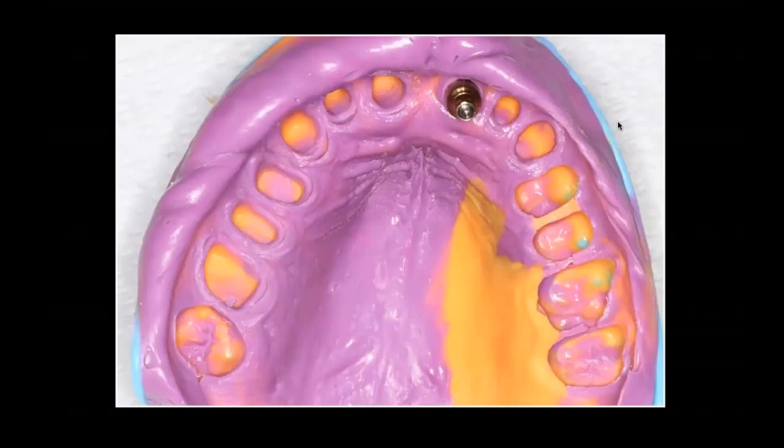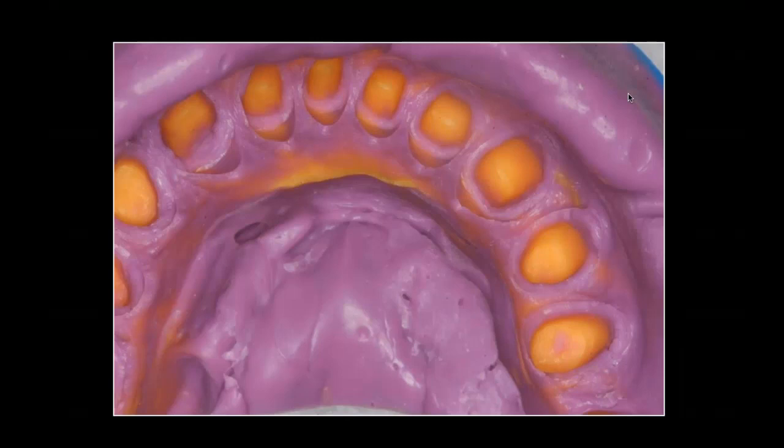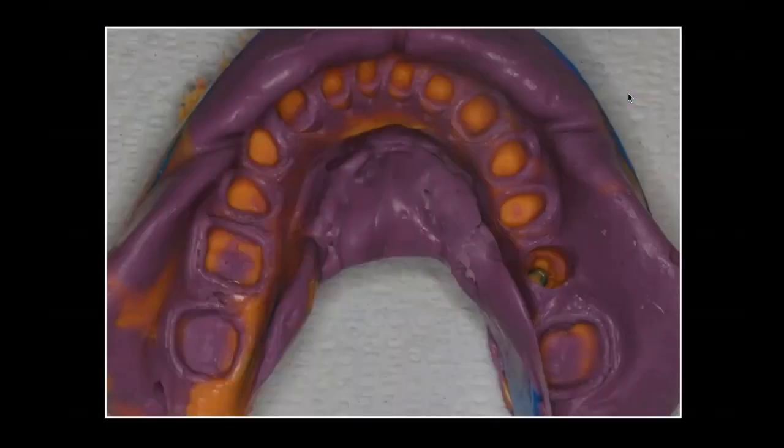Here is a patient I recently worked on where we had an implant in the front. You can see there's good isolation. You can see those margins, a nice chamfer shoulder prep. I'm very proud of this because my laboratory technician will use this to share with other dentists the type of isolation they want. This is ideal to show with an implant. This is the Panasil light initial contact with a tray material. Here's a little closer up, magnified a little bit, and you can see it here on the lower, same patient.